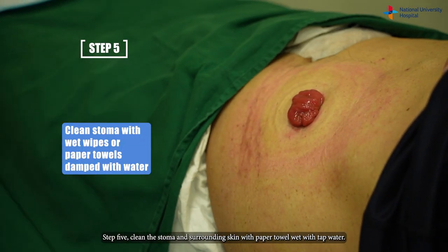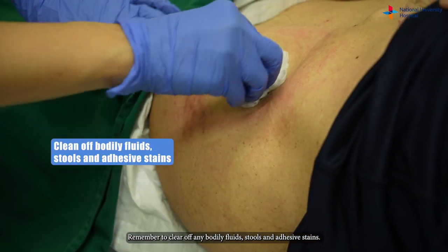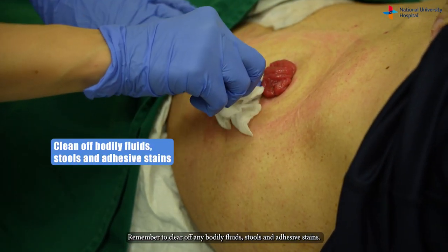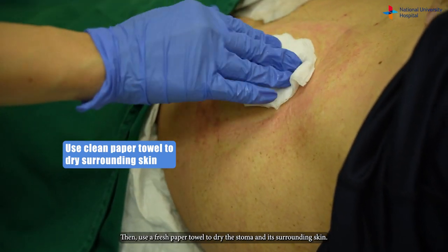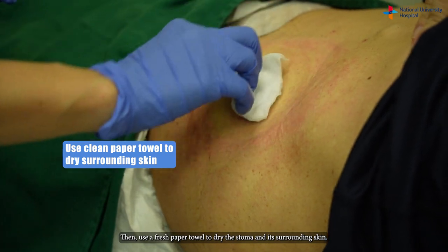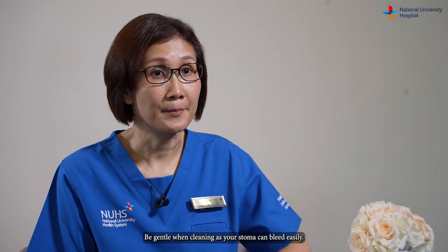Step five: clean the stoma and surrounding skin with paper towel wet with tap water. Remember to clear off any bodily fluid, stools, and adhesive stains. Then use a fresh paper towel to dry the stoma and surrounding skin. Be gentle when cleaning as your stoma can bleed easily.